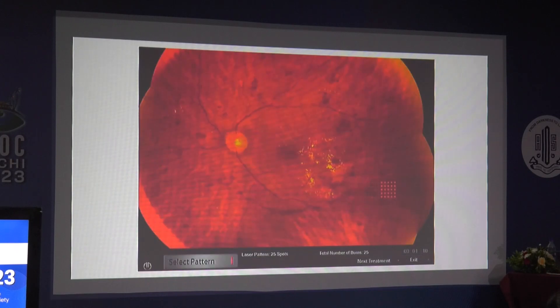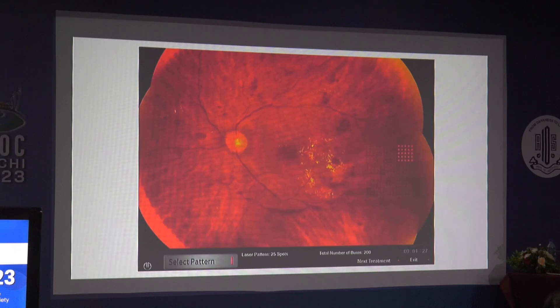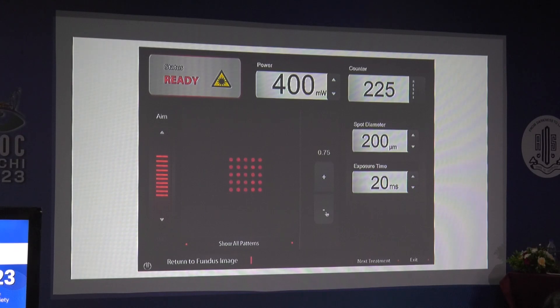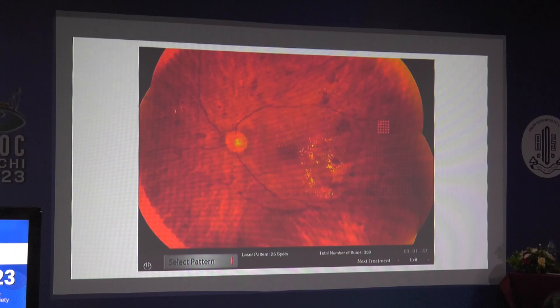We start in the periphery and look for uniform laser burns, which should be dirty grey in color — that is the target appearance. Burns should not be excessively bright, as that would mean we are using more energy than required. Because this is extensive disease, we can reduce spacing to give more compact burns, which might take more time but provides better coverage.